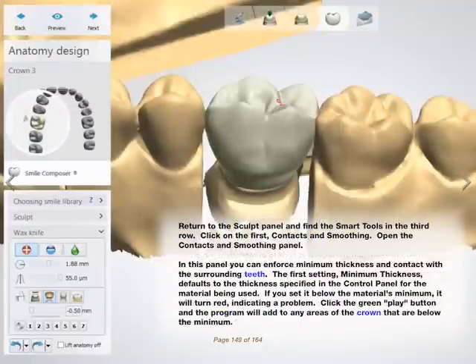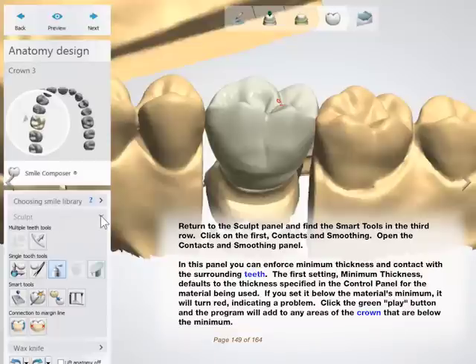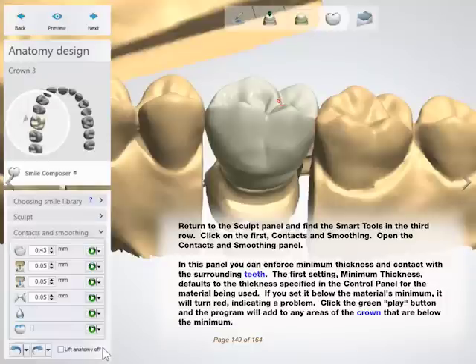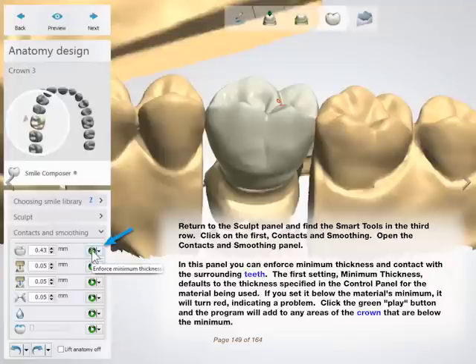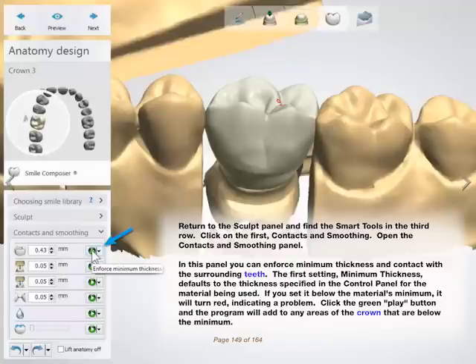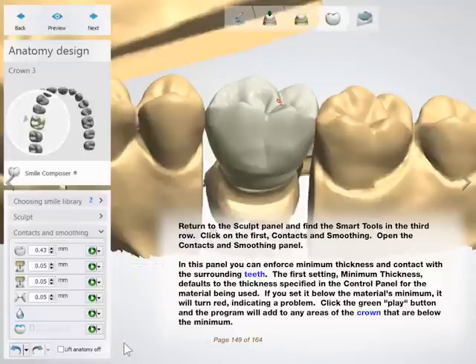Return to the Sculpt panel and find the Smart tools in the third row. Click on the first: Contacts and Smoothing. Open the Contacts and Smoothing panel. In this panel you can enforce minimum thickness and contact with the surrounding teeth. The first setting, Minimum Thickness, defaults to the thickness specified in the control panel for the material being used. If you set it below the material's minimum, it will turn red, indicating a problem. Click the green Play button and the program will add to any areas of the crown that are below the minimum.